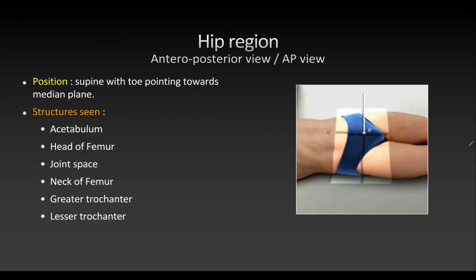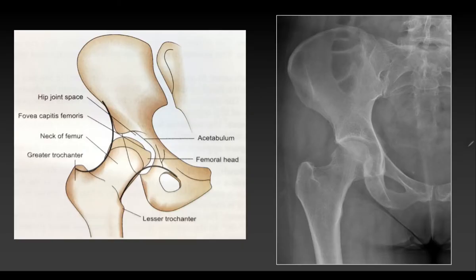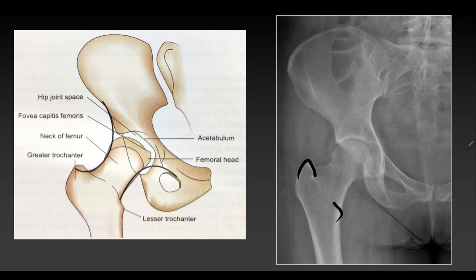First we will see the hip region, anteroposterior view. For this image we need to keep the patient in supine position with the toe pointing towards the median plane. This is to ensure that the neck of femur does not appear short. The structures seen in this x-ray are the acetabulum and the head of femur together forming the hip joint, the joint space between them, neck of femur, greater trochanter, and lesser trochanter. In this image, the white line is the margin of the acetabulum, this is the head of femur, and the translucent area between the two is the joint space. This is the neck of femur, this is the greater trochanter, and this small projection is the lesser trochanter.